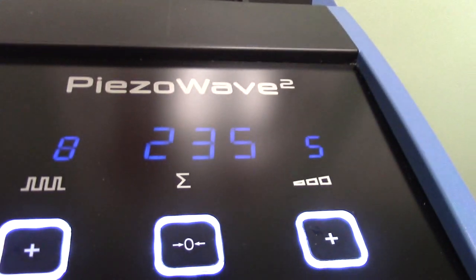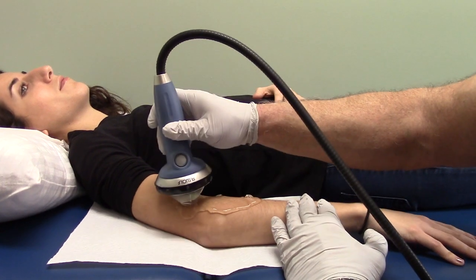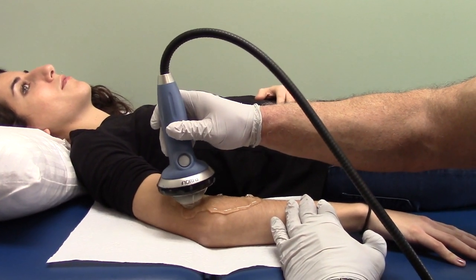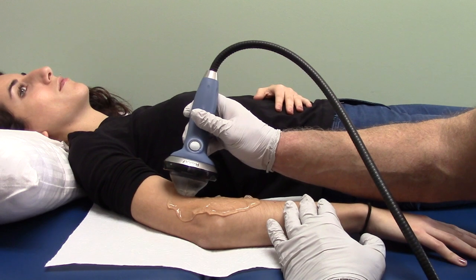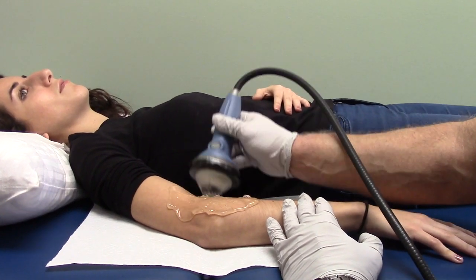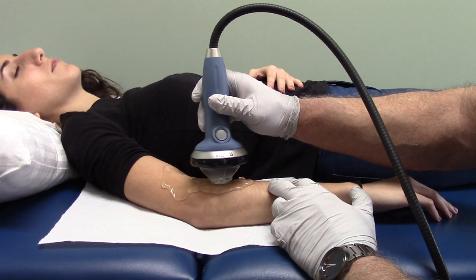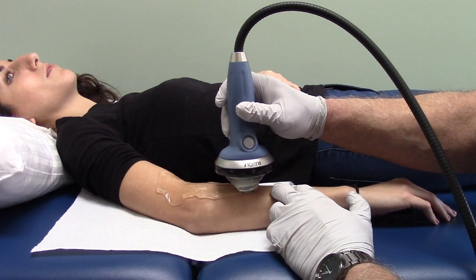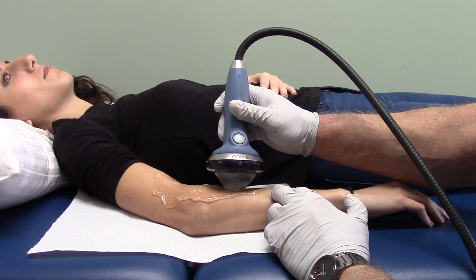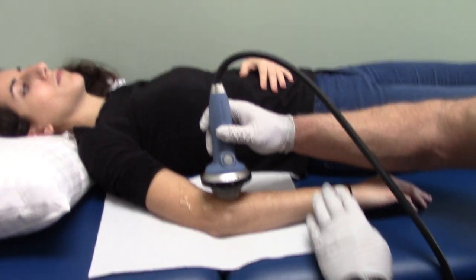We can see the total dosage. Normally for an extra-spinal area like an elbow or shoulder, I do about 3,000 pulses depending on the patient — how large or small they are. For a taller or bigger person covering a larger area, I might do 4,000 pulses. We also want to make sure we hit all the extensor tendons as they come into that lateral epi area. I like to cover a larger area going down the back of the forearm so the belly of the muscles are also affected, because this breaks up the fibrosis and adhesions within the muscle and not just the scar tissue around the joints.